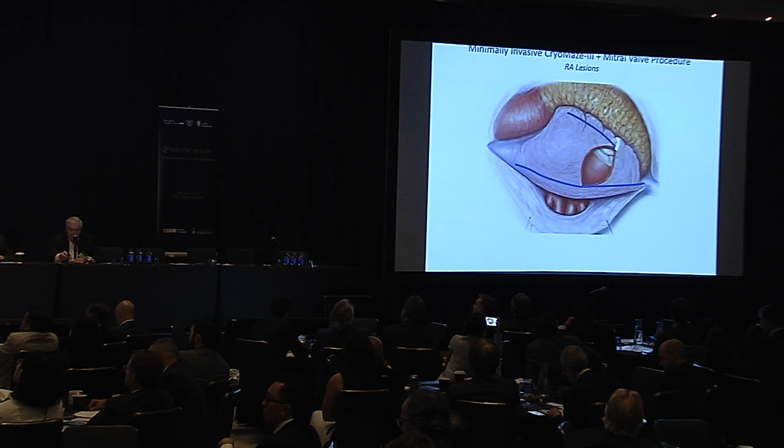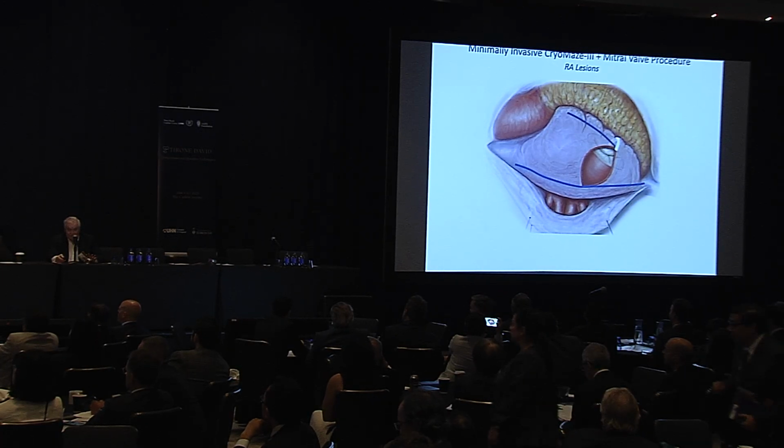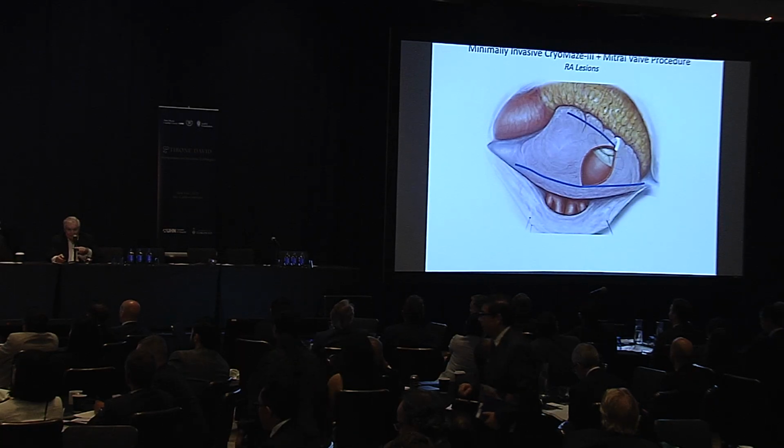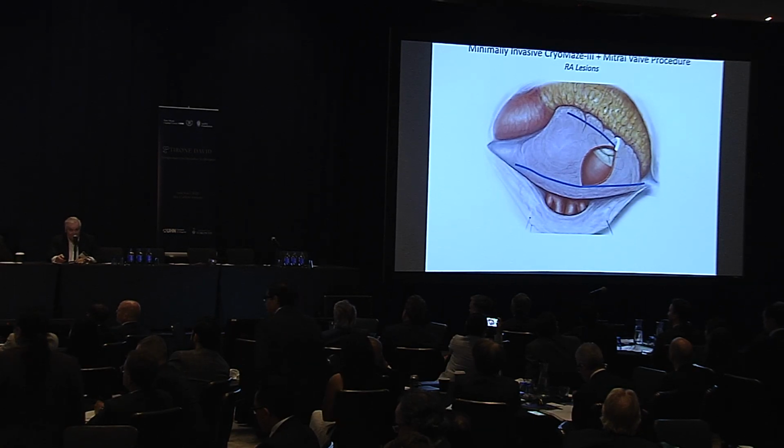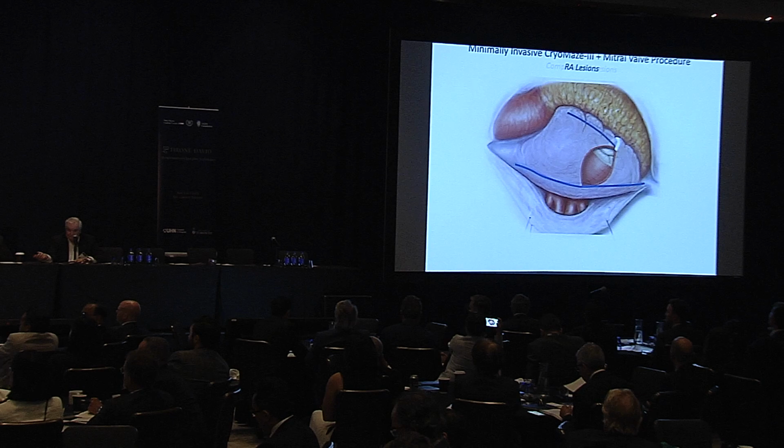But notice that there's an area between that last lesion we put on and the SVC lesion. That's what I call a no-touch area. Don't pick it up with forceps. Don't press on it with anything. Don't put clamps on it, for God's sake. Don't retract it hard. Leave it alone. Don't touch it, because that whole area can be involved in generating normal sinus rhythm. So you protect that as if it were your eyeball. That's a no-touch zone. Don't ever pick any tissue up there with forceps. You'll pay the price.